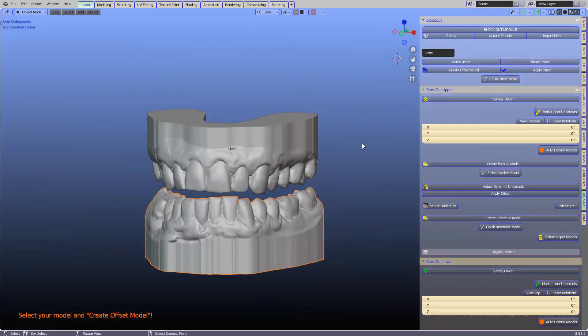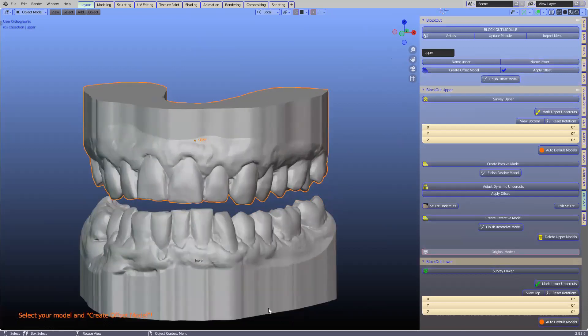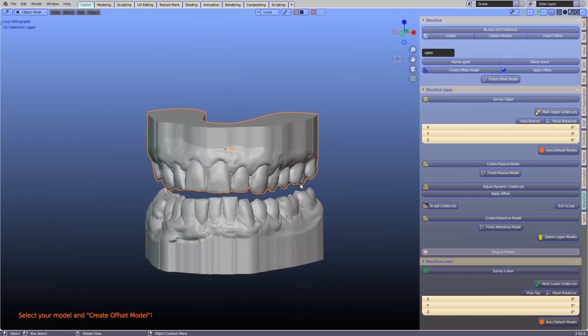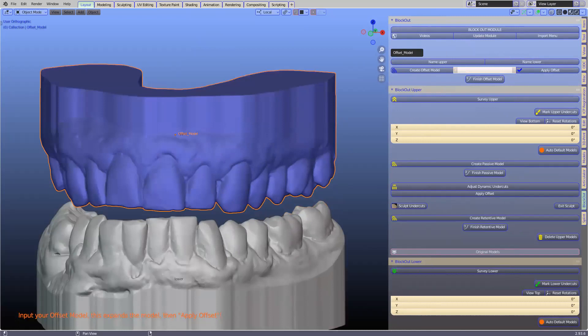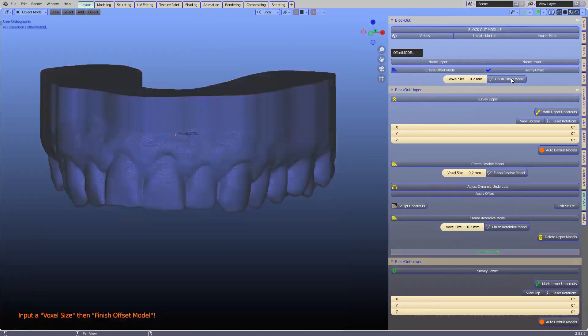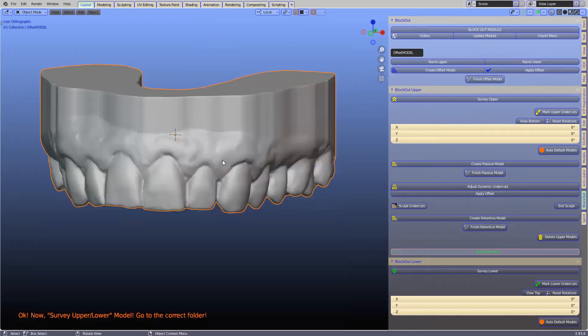The next step — what we would do in the lab is block it out. Go to block out and designate this as the upper and this as the lower. Don't simultaneously block out both at the same time; carry on one at a time. We'll do the upper first. Create offset — in this case with that printer we set the offset to 0.15. If your splints are too loose, this is where you adjust it. Apply that and finish this offset model.